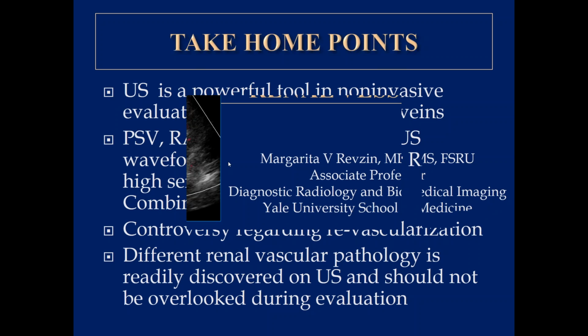Also, if you don't find any flow within the cortex on power Doppler, then you could be more certain that there is definitely no flow and there is probably an infarct or maybe an abscess in the cortex of the kidney. Also, power Doppler is independent of the direction of flow, so it's not going to depend on 90 degrees to the vessel, which would show no flow within the vessel. So power Doppler is really better.